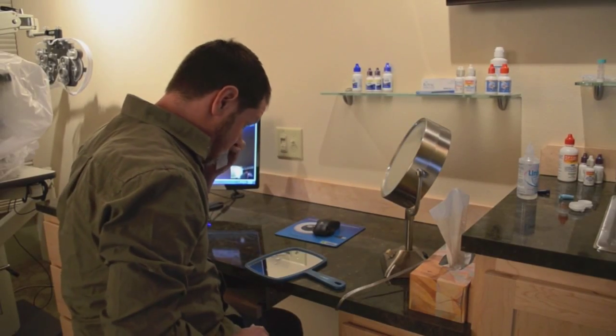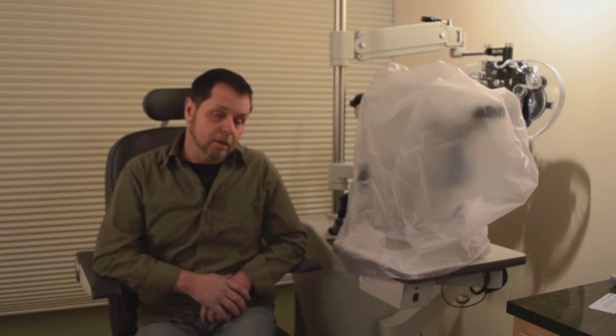It's in. The process for having my eye molded was actually a breeze. It went by so much faster than it took to explain it. It felt like I knew what to expect. I was a little nervous about somebody working so close to my eye, although it wasn't painful. People with really bad astigmatism will see much better. It's non-invasive. Being able to see well means a lot to people. It means a lot to me. My eye right now — I can't really tell that I have a contact in my eye. It's quite nice.